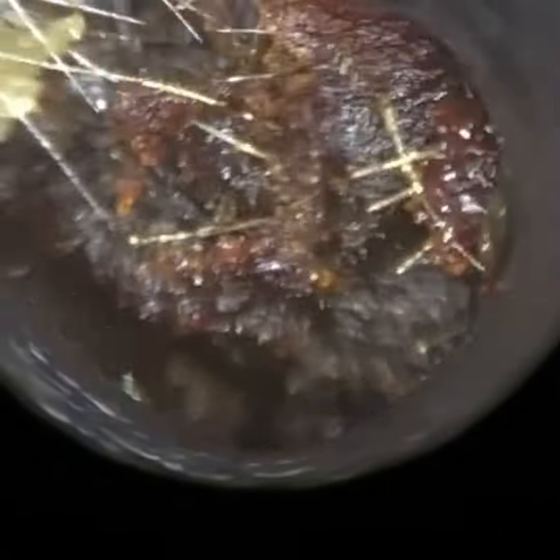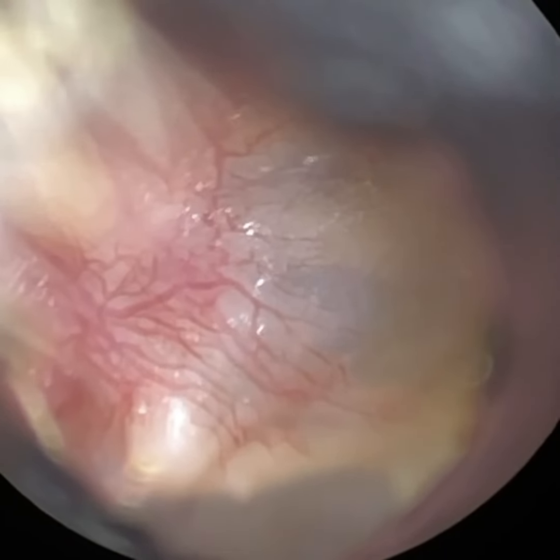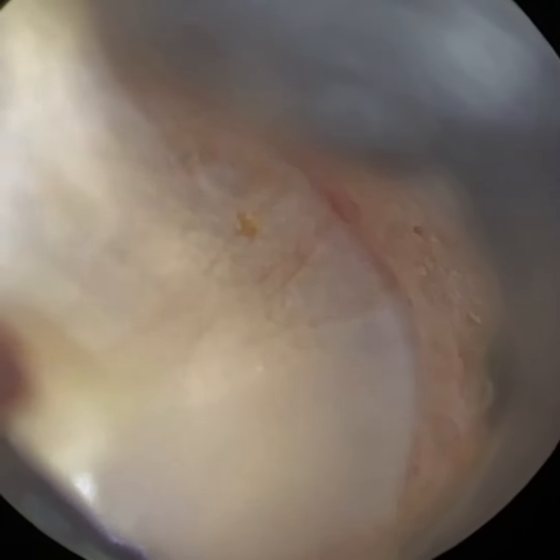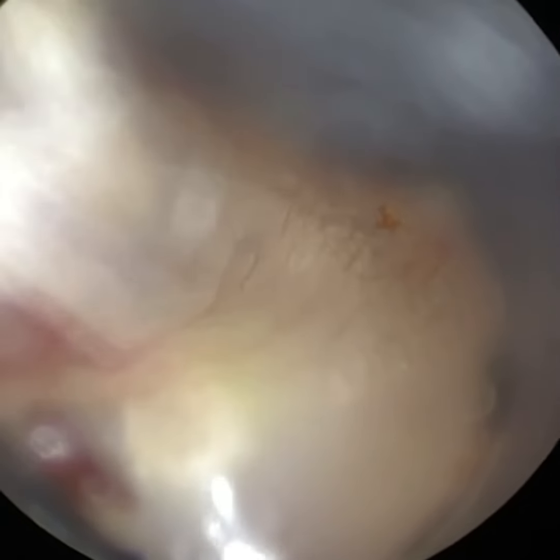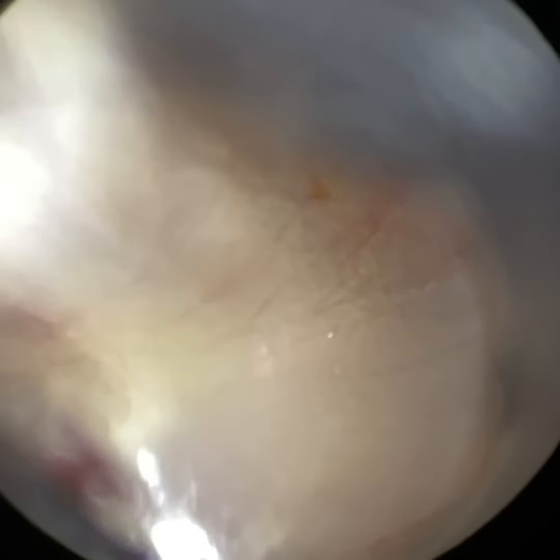That's quite a large piece there, and I think this is the second piece. It got trapped at the entrance because, as I mentioned, the entrance is quite narrow. I'm just getting the hook in and behind, and literally prizing it forwards. There's the big mass. Now if you look at this eardrum — I'm going to dilate the ear canal and adjust the focus — you can just see how focused and clear that is. I'm really, really pleased with that.